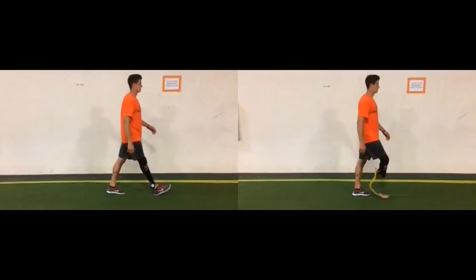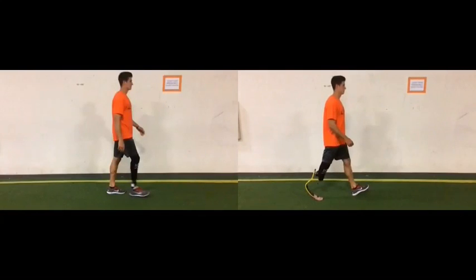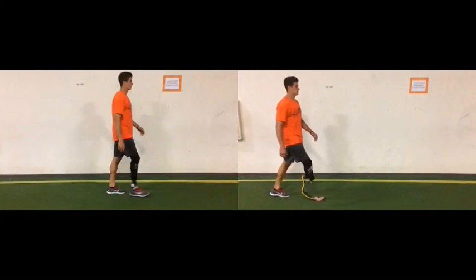Whereas the sprinting prosthetic, let's go ahead and watch that. There's not much knee extension, or at least not as much. The knee still remains fairly flexed, and I believe this is because if I were to extend the knee out as much as I do on the highly active walking foot, the return from the prosthetic would actually push me backwards. Right now, the angle of the prosthetic, because there's not much force going into the ground, still allows me to somewhat go forward.